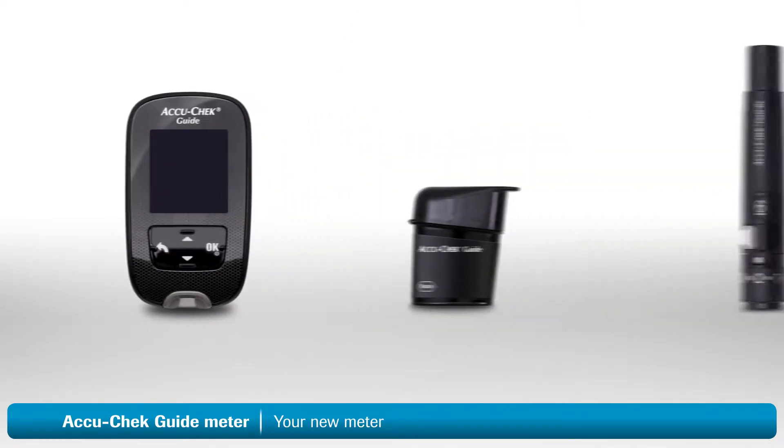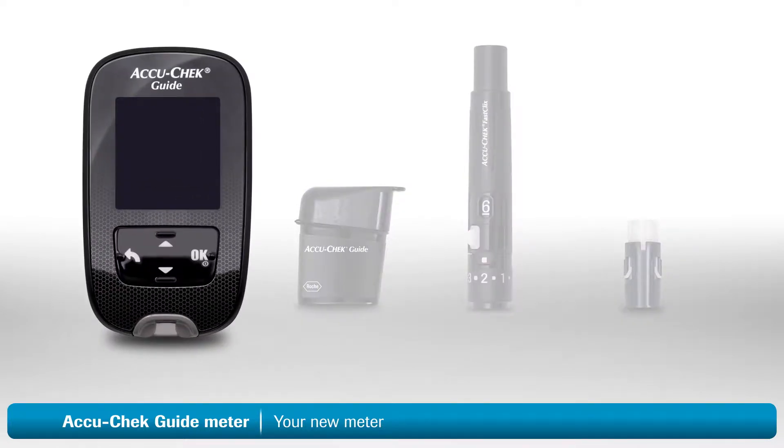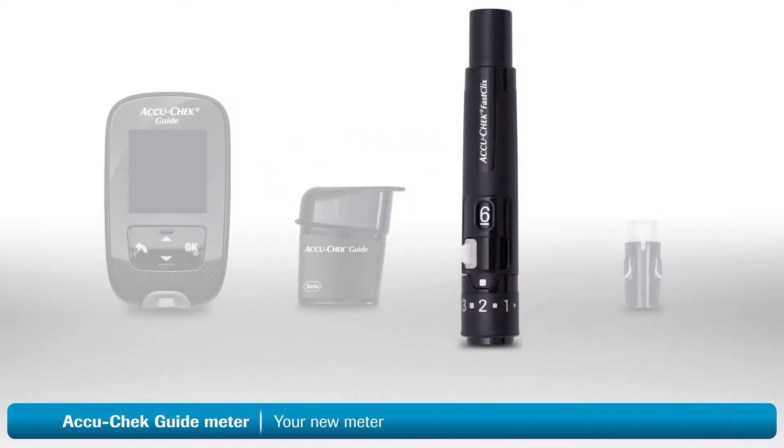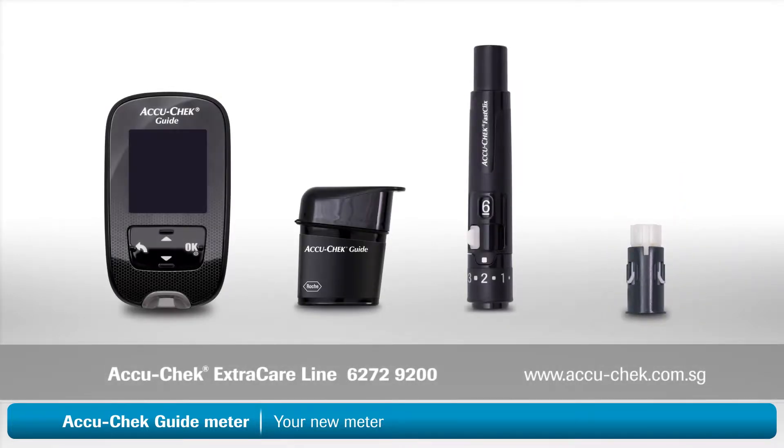The first thing to do is to make sure that you have everything you need to start testing. You should have the following items: an AccuCheck Guide meter, a container of AccuCheck Guide test strips, an AccuCheck FastClicks lancing device, and an AccuCheck FastClicks lancet drum. If you can't find something, or if you need assistance with any of the steps that follow, just contact AccuCheck customer service.